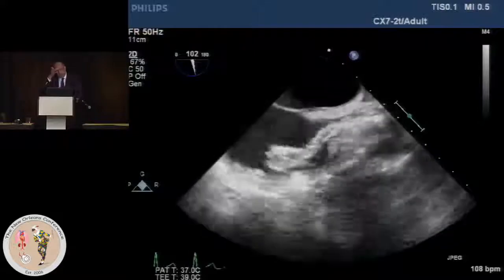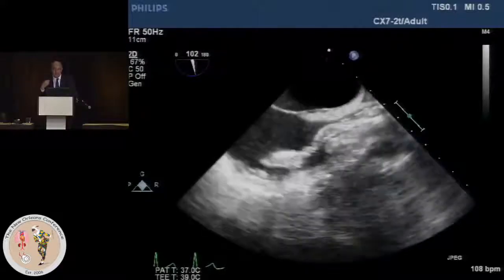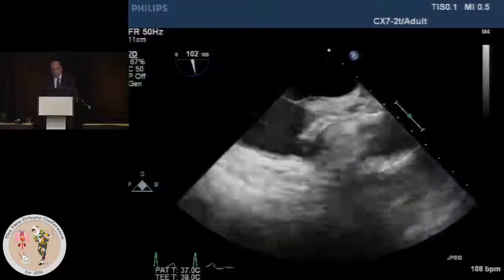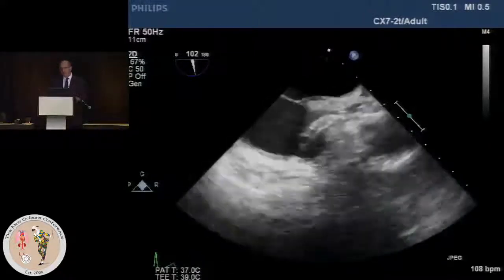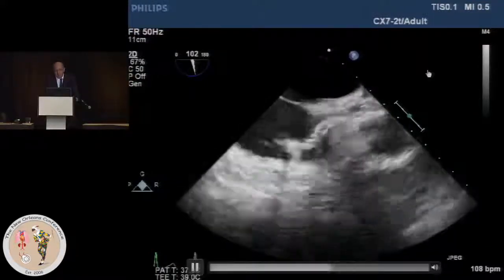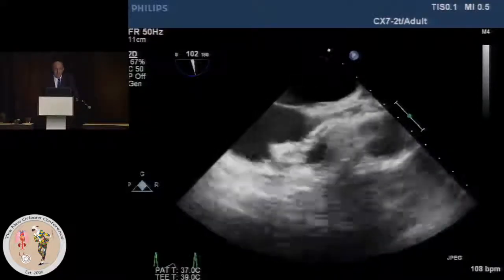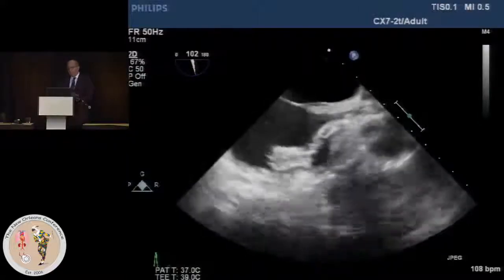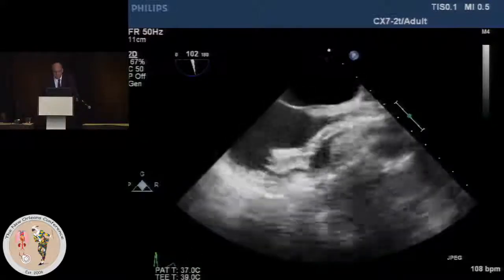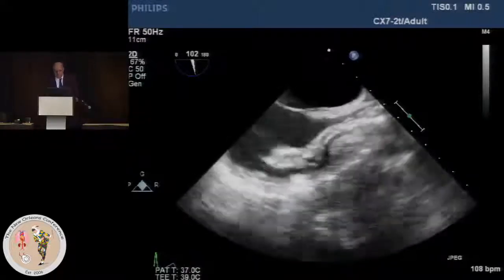This is a 45-year-old lady who had short bowel syndrome and had a central line for TPN, and over time developed a mass associated with the tip of this line and developed candidemia. She had a fungus infection, and she was extremely sick, and we had every reason to believe that this mass over here in the right atrium was a fungus ball. Very high-risk patient. She's had previous arm amputation that was done because of trauma, has short bowel syndrome, like I mentioned, and really not somebody that we wanted to operate on to remove this with an open technique.